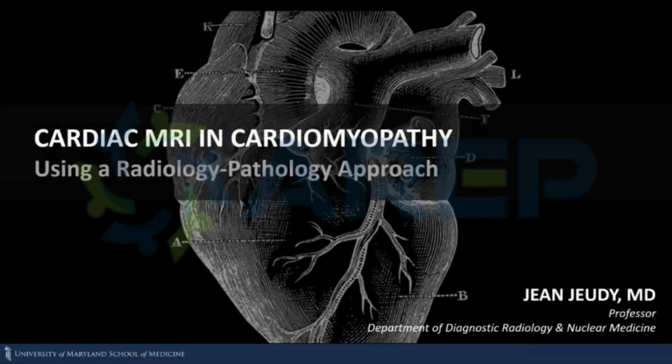So my discussion today will be on cardiac MRI and its use in cardiomyopathy. And again, we know that cardiac MRI is not something that is widely used, but still has a very important role in the evaluation of cardiomyopathy and is becoming more and more important in the evaluation.